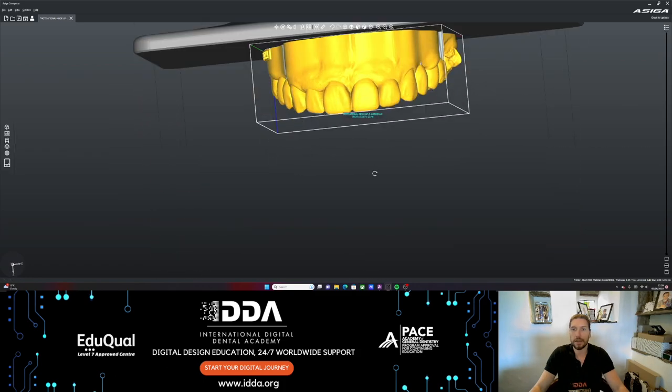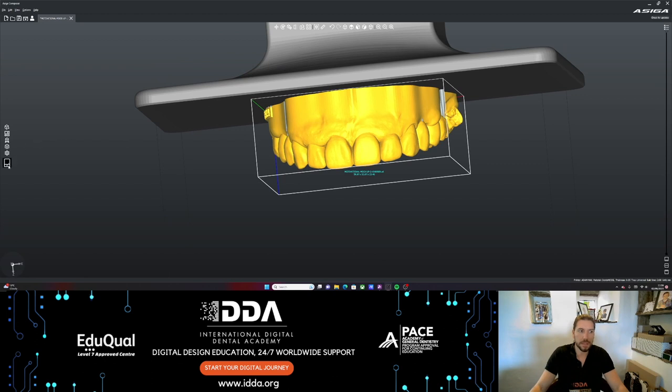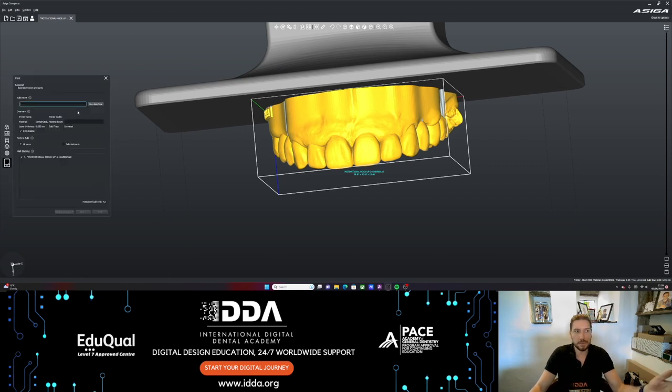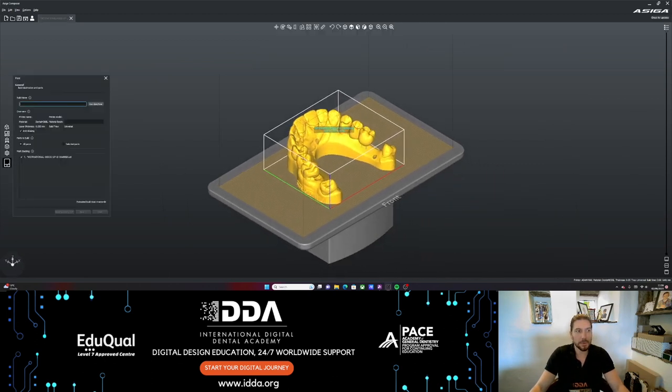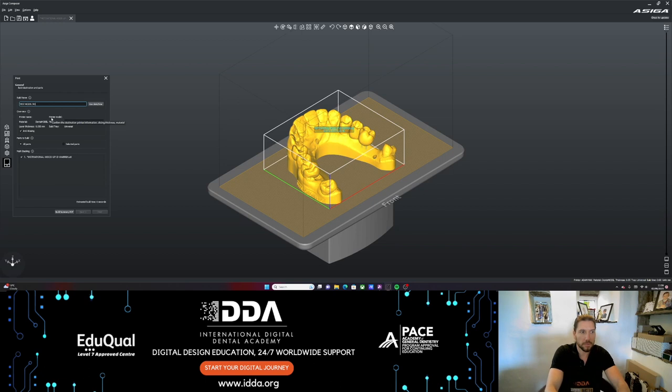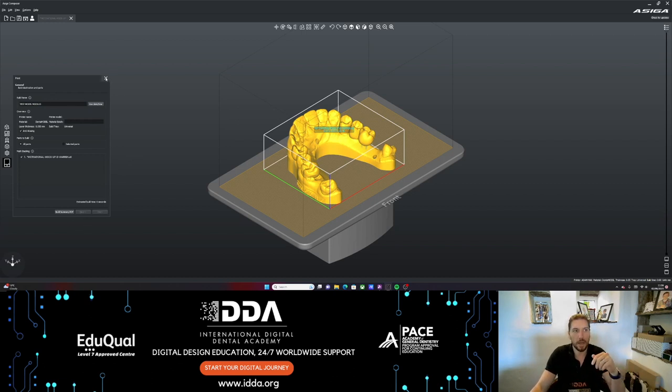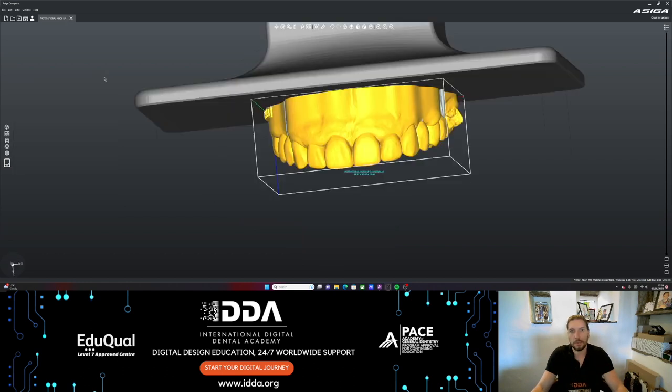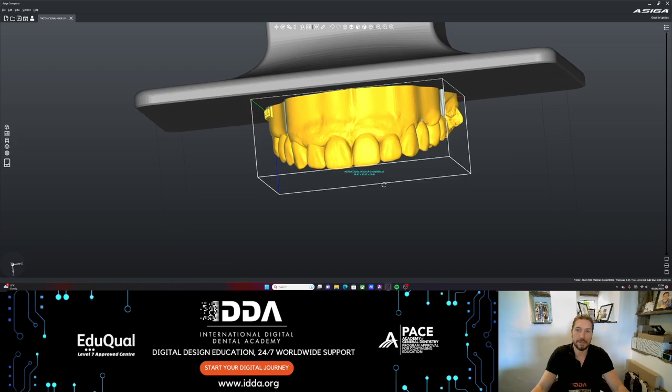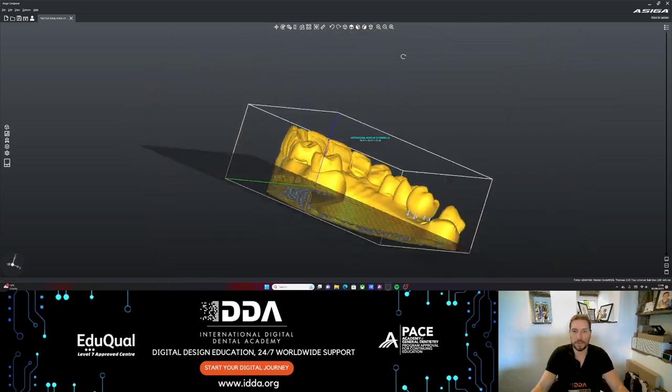We've got that all set. Everything is ready to print. It's going to print like this. This is how it's going to look when it comes out of the printer. Then we just click on the printer and set it to print, select the build name, and type that in. The printer's offline so I can't click next, but then it would set it to go. We can always go to the software through the software or through the printer itself to select that to start, which you would know from having a Max UV.